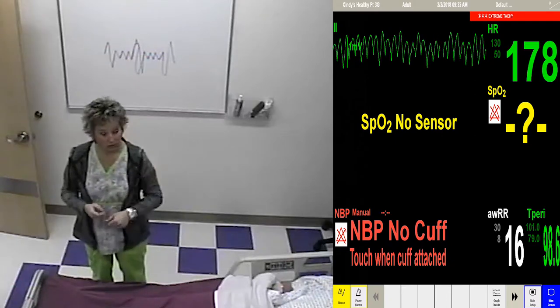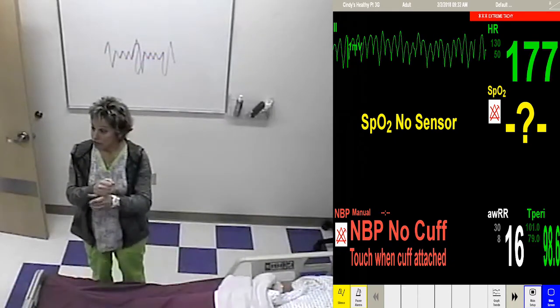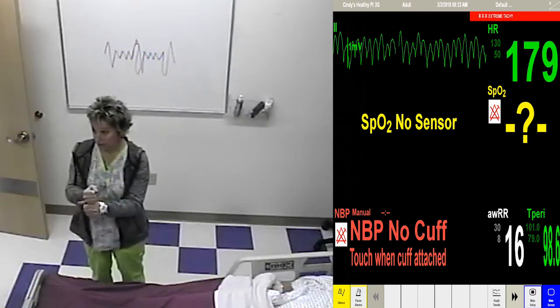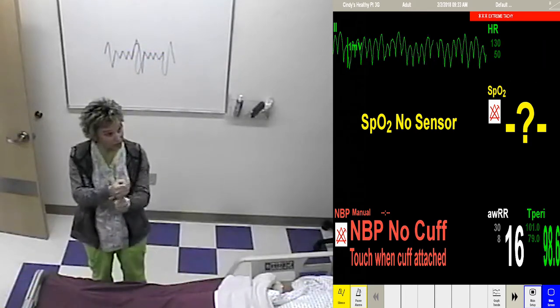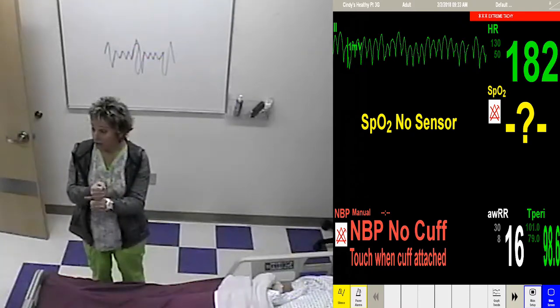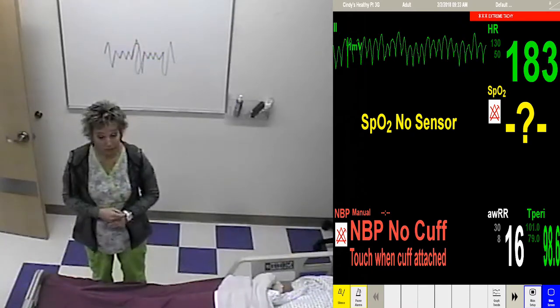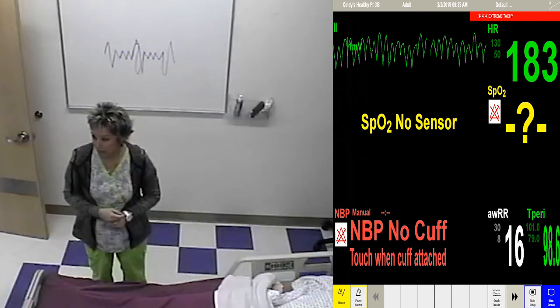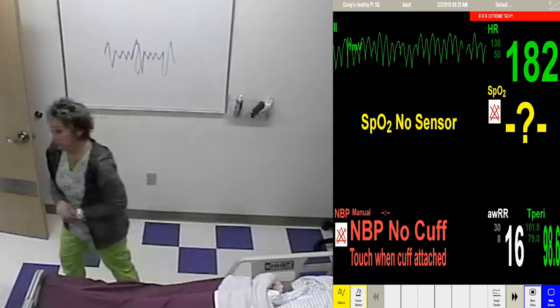Can you picture it? Okay. So what's your ventricle doing? It's just pumping. What's your atria doing? Nothing, because we don't see any atrial activity, do we? Okay. Life sustaining? No. Not for long. That's exactly right. Does that make sense? Yes.